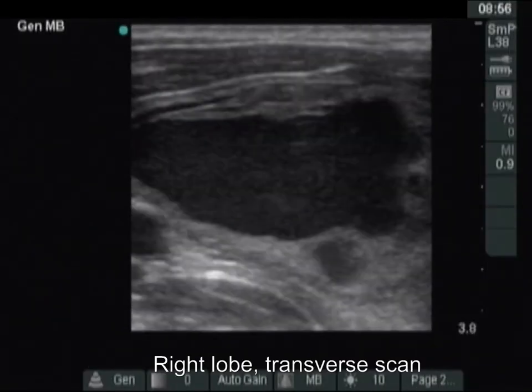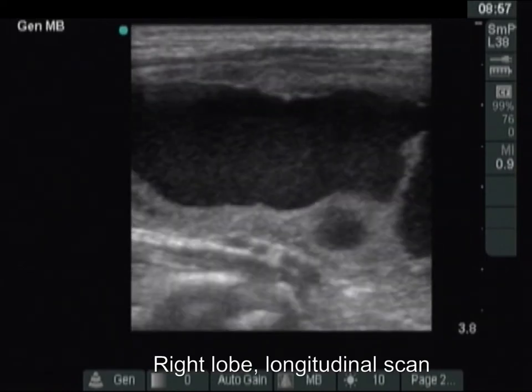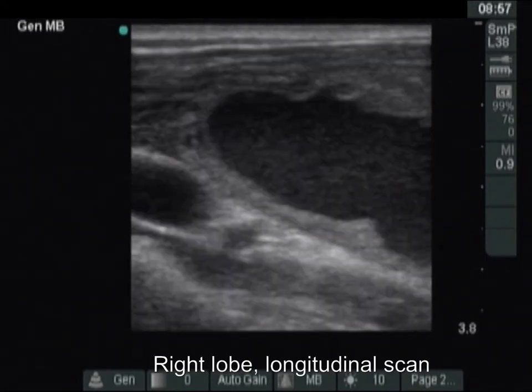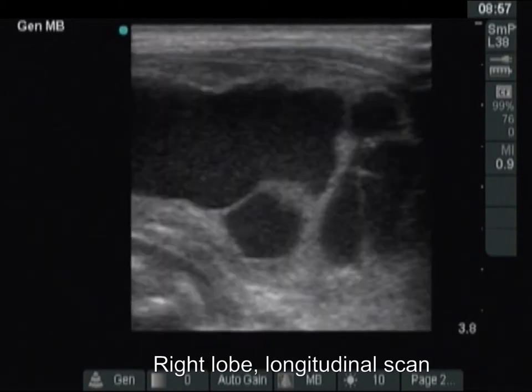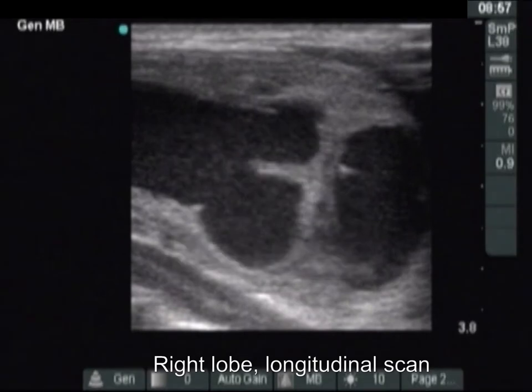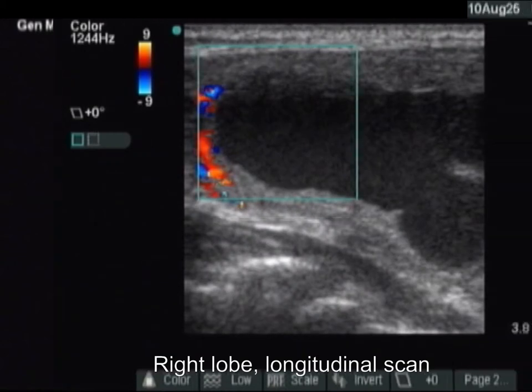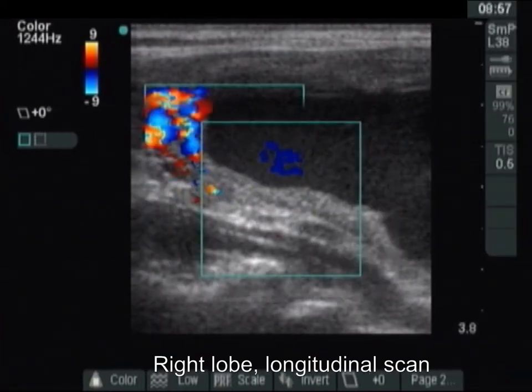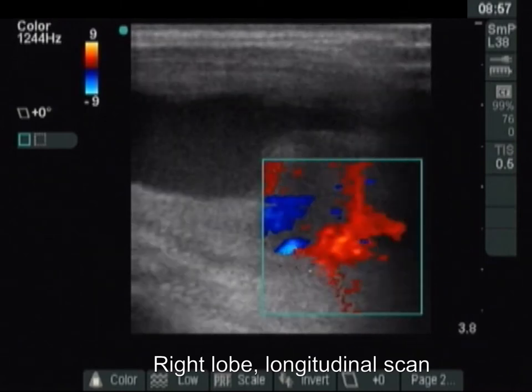The patient has suffered a neck trauma while boxing for 5 days. He noticed an increasing mass in the right side of the neck within hours after the trauma. There is a central type cystic nodule with a neck and normal solid rim. The fibrotic bundle dividing the cyst has been torn. Such rupture is rarely observed on ultrasound. The presence of halo and paranodular blood flow discloses that this is not a pseudocyst but a cystically degenerated nodule.